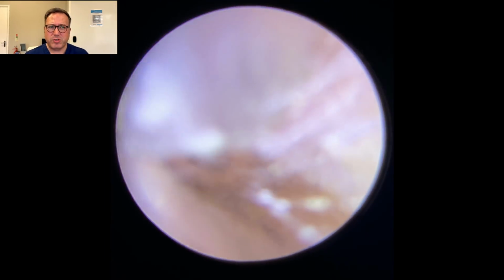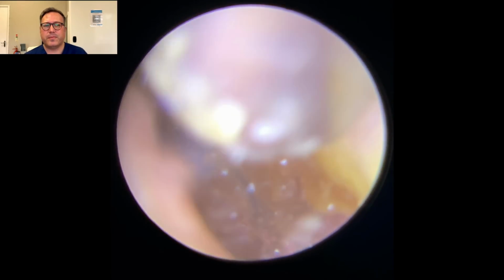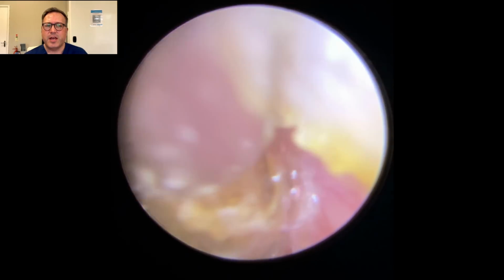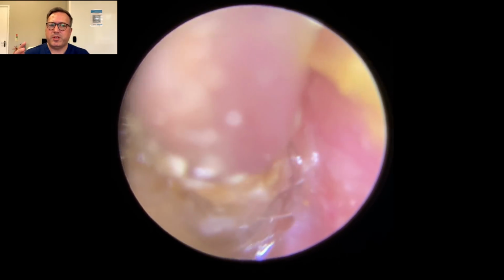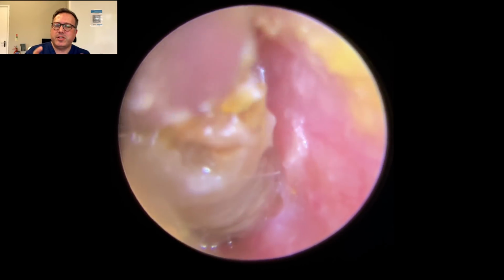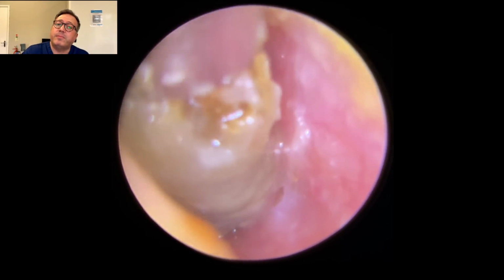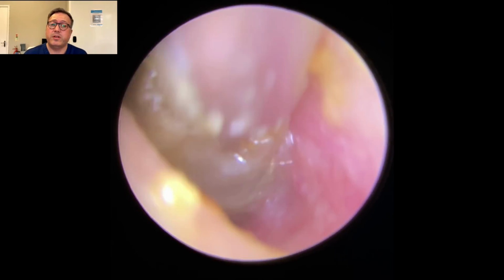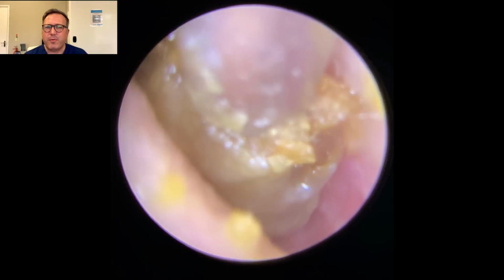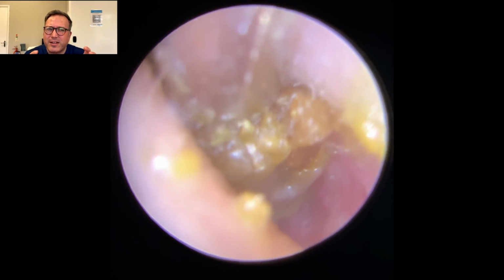So we've introduced a little bit of olive oil in here. There we are, just lifting from the sides. It's really going to stop this wax from adhering, and you'll see there's a little bit more movement now to this wax. The difference it makes by introducing that olive oil is quite substantial, especially with this drier type wax like this. There we are, it's just starting to move again, a little bit of a wiggle to this now.